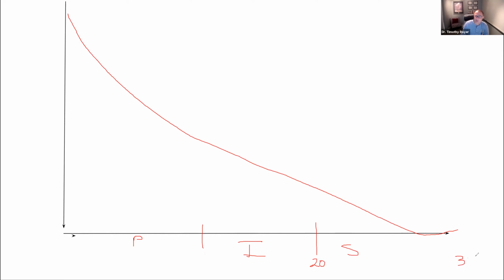Well, back in the 80s and 90s, a bunch of researchers wanted to look at, well, what happens in substance abuse? We talked a little bit about marijuana, but in substance abuse in general, alcohol use, other substances. And what's a very interesting thing that happens is it's not just an elevation of the fast waves, like we've seen in anxiety, where it just tends to be this whole thing's a little bit higher, okay?